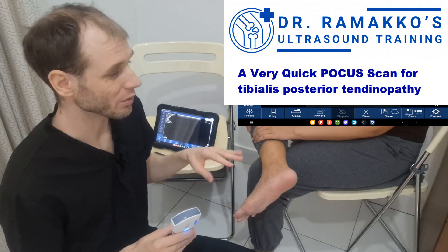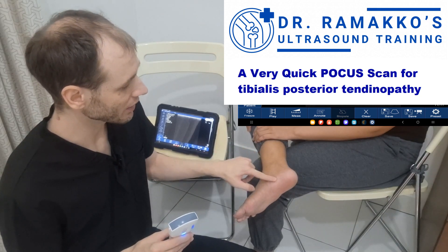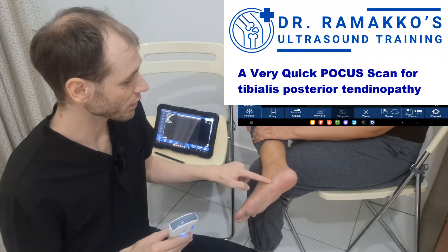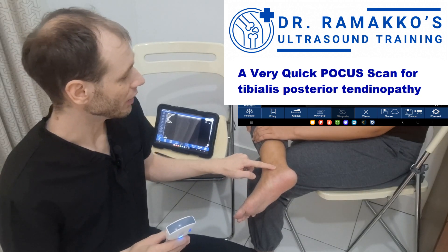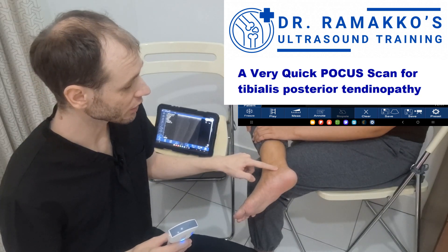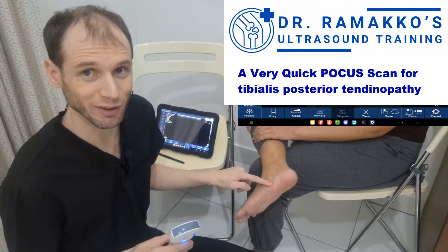This is a very commonly misdiagnosed condition because the pain can radiate and be misdiagnosed as plantar fasciitis, for example, since it courses basically to the navicular region on the plantar surface. It could also be misdiagnosed as Achilles pain. If there's a full rupture, it can cause an acquired flat foot because it's one of the structures that maintains the arch of the foot.